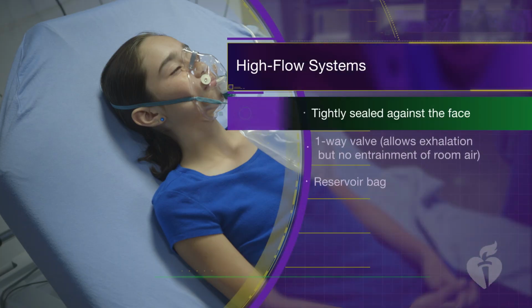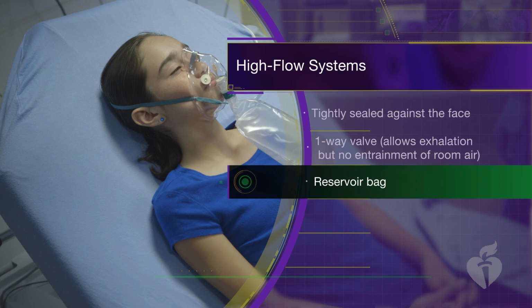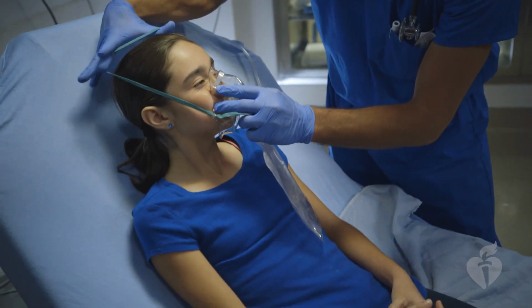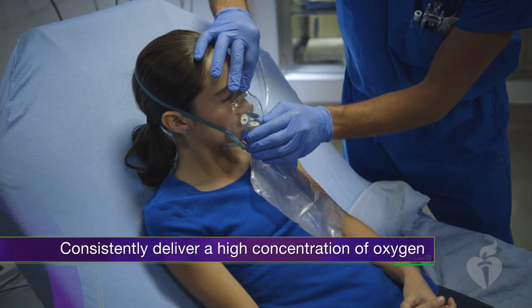Some patients will need more support than a low-flow oxygen system. High-flow systems may be helpful for these patients. They come in two varieties, those that have variable oxygen concentration and those that do not. These systems include a mask that is tightly sealed against the face, one-way valves that allow patients exhalation but no entrainment of room air, and a reservoir bag. A commonly used high-flow system is the non-rebreathing face mask. One advantage of this device is that it allows you to easily deliver consistently high concentration of oxygen approaching 100%. Non-rebreathing face masks are always connected directly to oxygen.